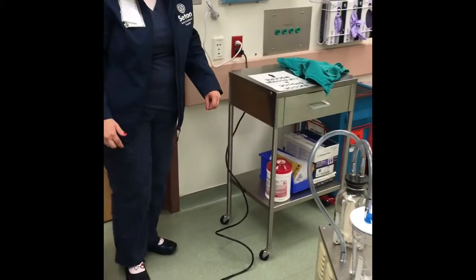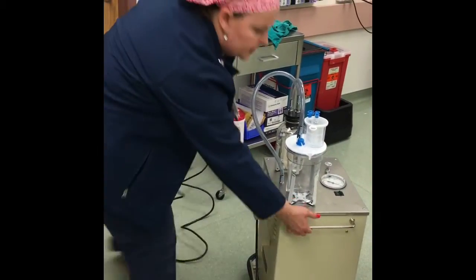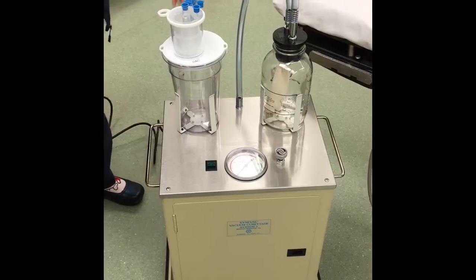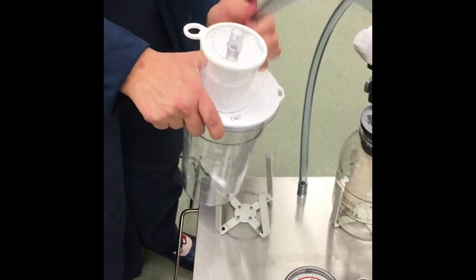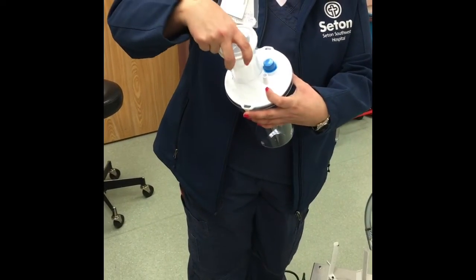Always into a red outlet if possible. So this unwinds to give you plenty of room. It rolls around. What you need to check on this machine is you need to always make sure that you have a canister that has a filter, and this is another filter.